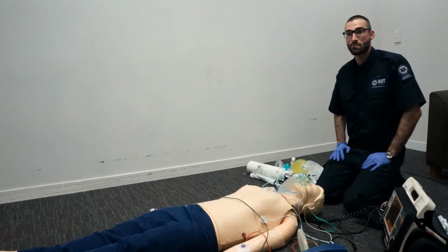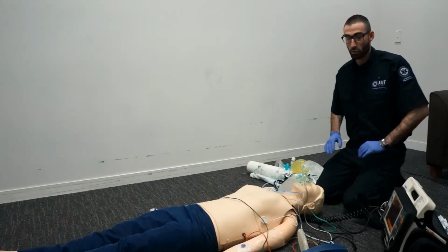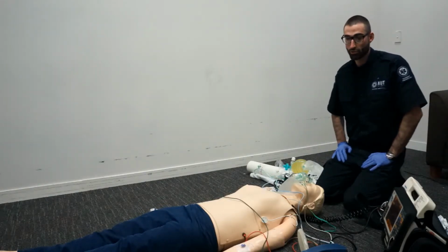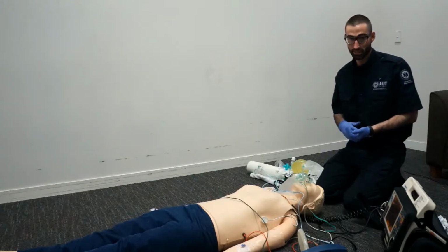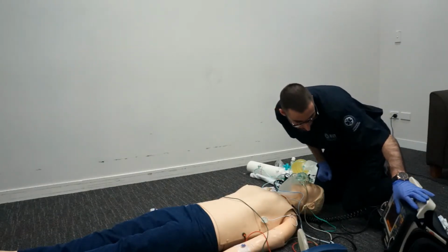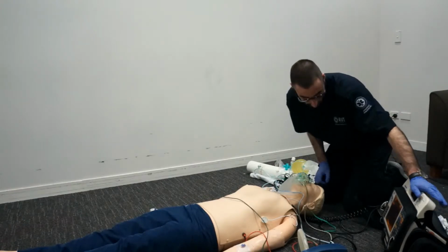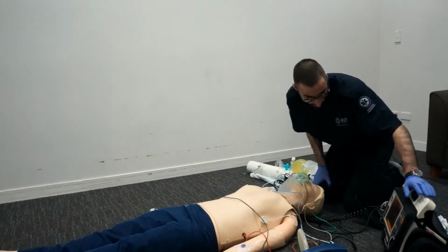If administering a second cardioversion, confirm the defibrillator is still in synchronized mode. Okay, so if we were to deliver a second cardioversion, we'd also reassess the ABCs and get another full set of vital signs and do another pulse check. Then we'd go ahead and press sync here and just make sure there's a detection symbol on every QRS complex.